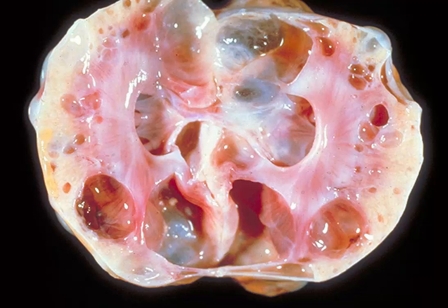Okay, time's up. Not an uncommon condition in a certain breed of cat, and that's Persians. And this is a polycystic kidney with variably sized cysts throughout the kidney. And one of the keys to this, beyond the cysts, is the absolute yellow-white characteristics of what's left of the cortex. That's because this cortex is pretty much what you're seeing in the big cysts.